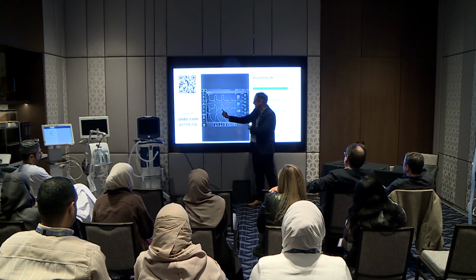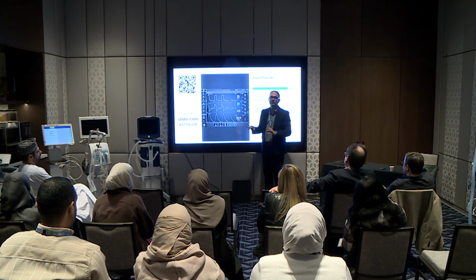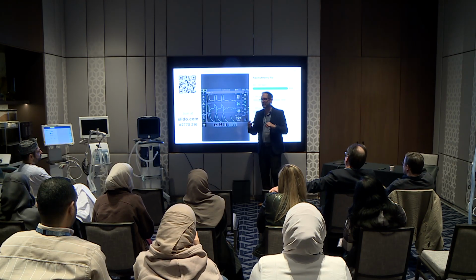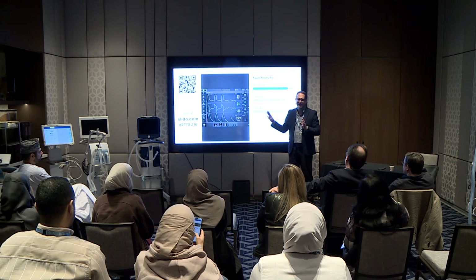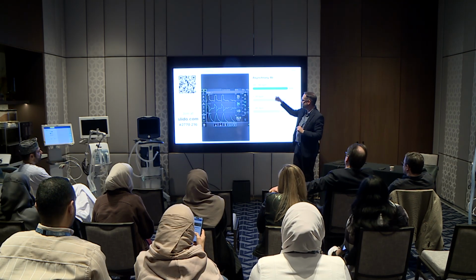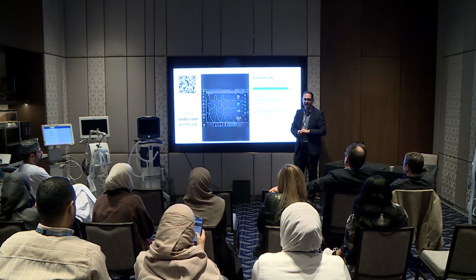Ineffective effort, ineffective effort, ineffective effort. So at bare minimum, it's going to be close to double. So if you said 30 to 40, I'm okay with that. The bottom line is it's higher than what you see, okay? Both of these I would have accepted. Right off the bat, if I multiply that by 2, it's over 40.